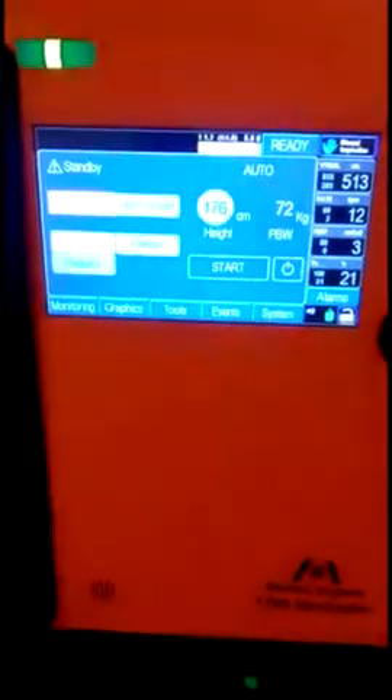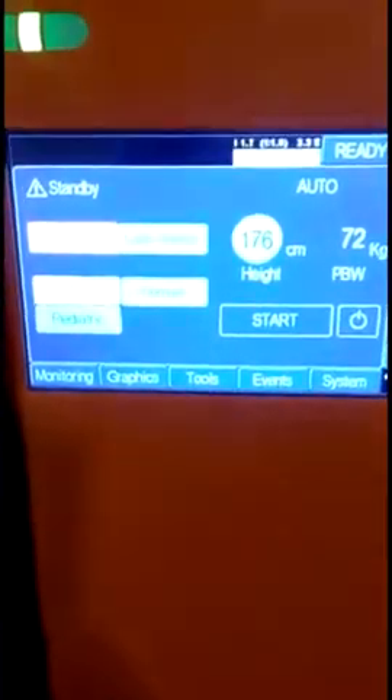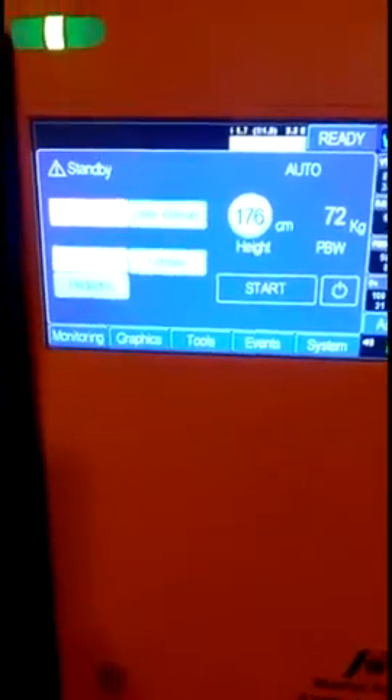This ventilator has a 4-hour battery backup but it also runs with mains power. The power socket is here and the input voltage is 110 to 220 volts AC. It can also run with a 12-volt DC adapter for charging in an ambulance.